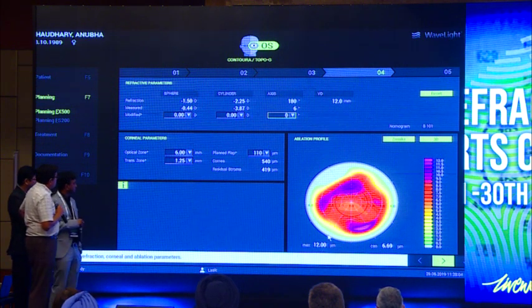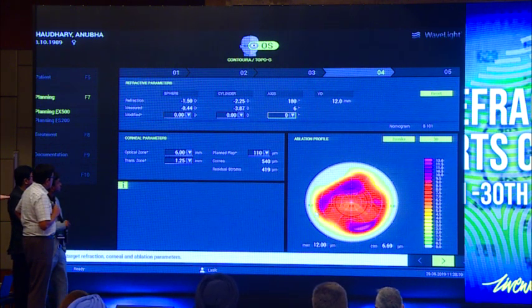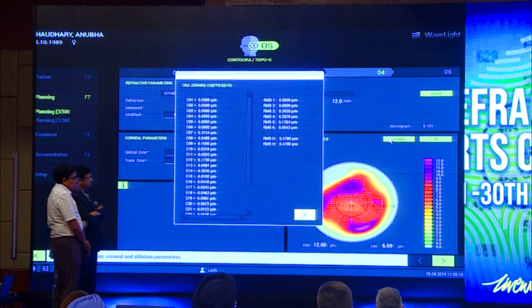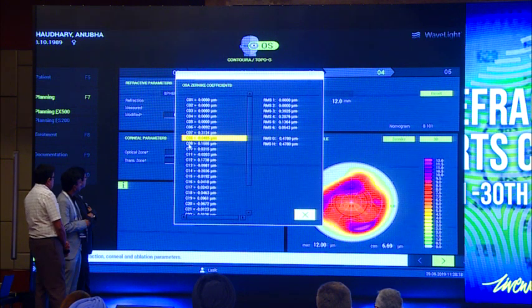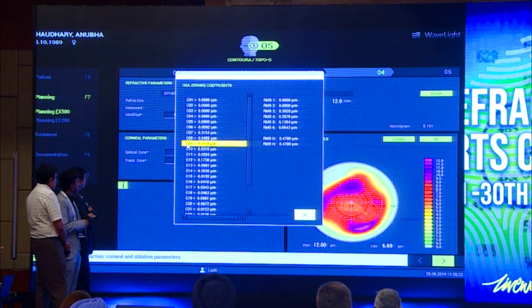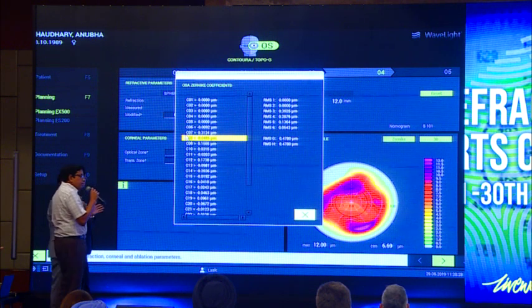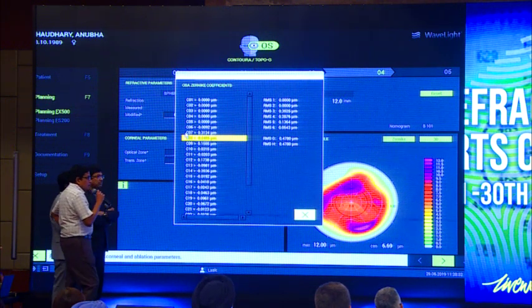We'll try to get the Topolyzer connected so that we can show the Fourier a little later. But I'll start with Dr. Nitin again. How would you treat this? I will first see the Zernike. The Zernike first. Yes. So you know that all the aberrations are on the higher side. C9 is very... C7 also. C7 is 3. So what are you specifically looking for in the Zernike here? Coma. I'm looking for coma, I'm looking for trefoil.